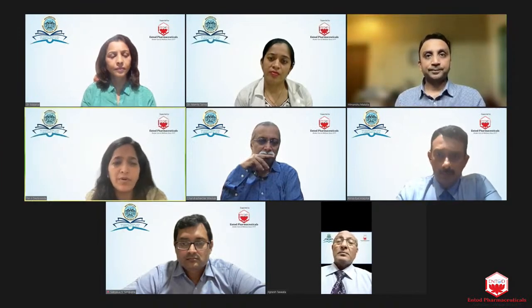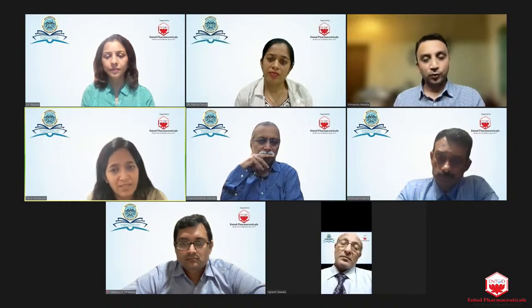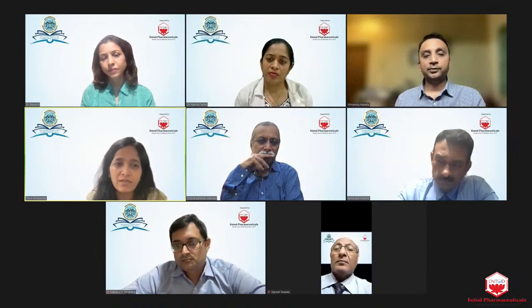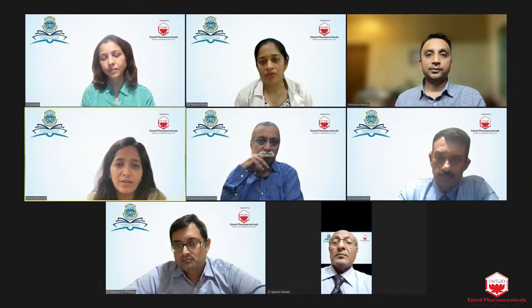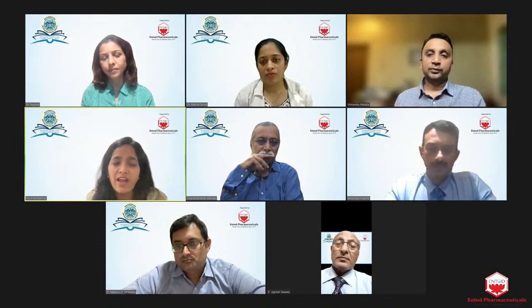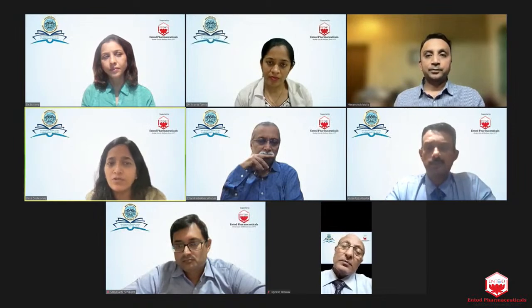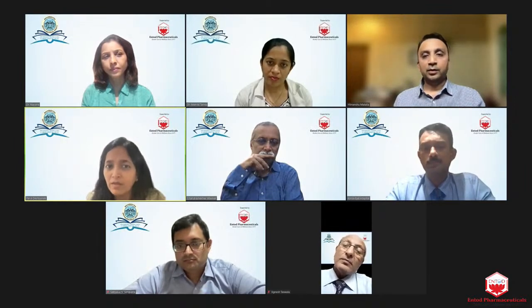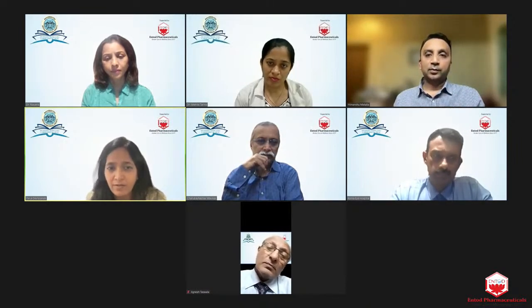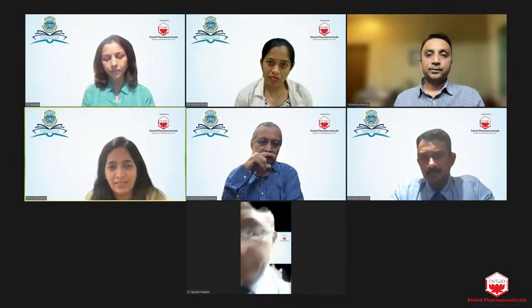So the two points, Himanshu, that I have. One is that subjective refraction may not be possible in many cases if you have an advanced case. True. And second is that sometimes you have an astigmatism which is regularly irregular rather than irregularly irregular. So if you have an advanced case where you have a central cone and a high astigmatism, do you think you would still attempt to do a toric IOL to debulk the cylindrical value so that you can achieve a better best spectacle corrected vision? And if you decide to do, how would you plan that case?